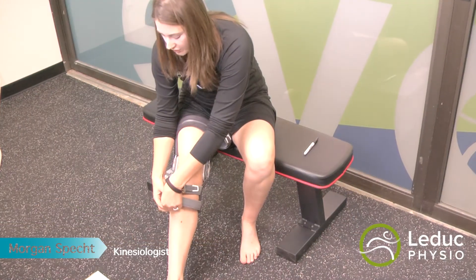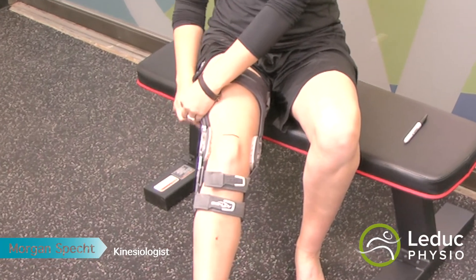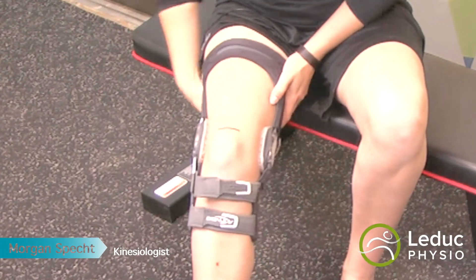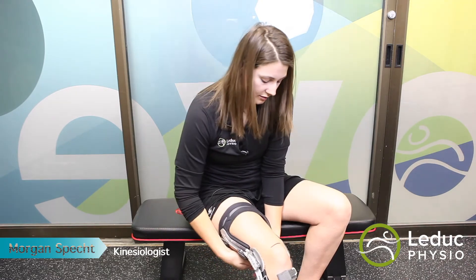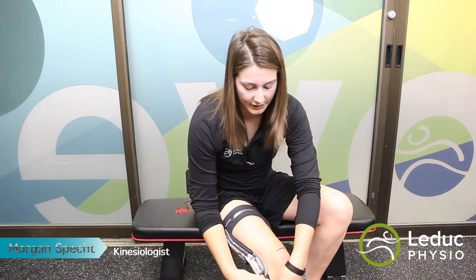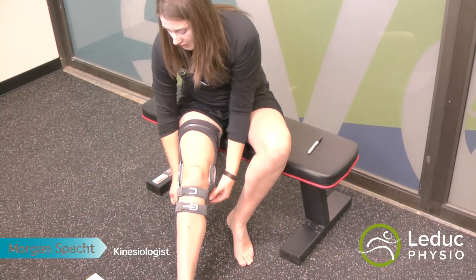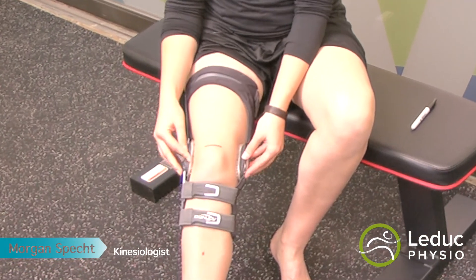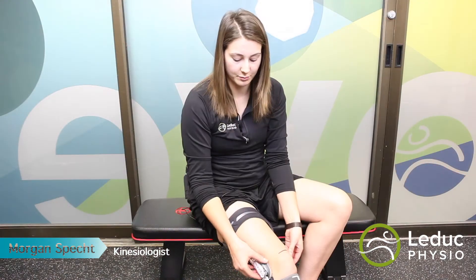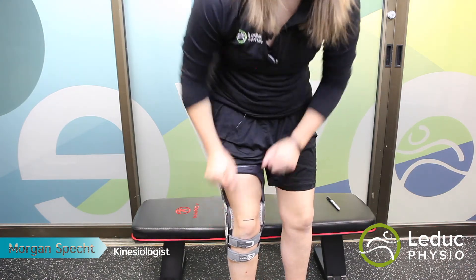There are five straps usually on the brace. Starting with the bottom one, you want to do the straps up nice and snugly without being uncomfortable. Then the top one goes around the back, then top, bottom, and there's one behind the calf that adjusts where the brace sits for depth on the knee. Make sure the hinges are not sitting too far forward or you'll get some gapping at the pads. You want to make sure you can't fit your fingers anywhere inside the brace. When you stand, the middle of the hinge should be at the top of the kneecap.